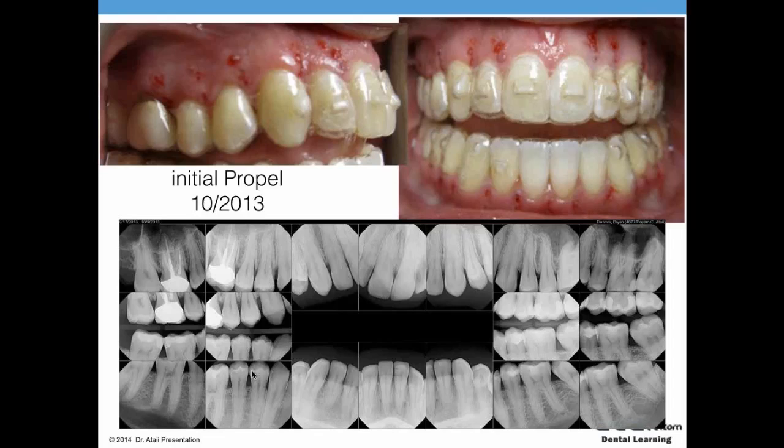I'm a strong believer in making sure that the treatment that we give our patients is always on track. And as you can see, the formula is typically 6 weeks of aligner treatment, changing the aligners once a week. That's 6 trays, and about 10 to 12 weeks introducing the microosseous perforation, which would be using the Propel device. And that's the formula in my practice. So I call it the 6-6-12 rule, and that really helps the patients understand, okay, after about 10 or 12 weeks, they may need it. Normally on a patient, you may need 1 to 2 introductions of Propel, and that's just about it. On more difficult cases, you may need a third.